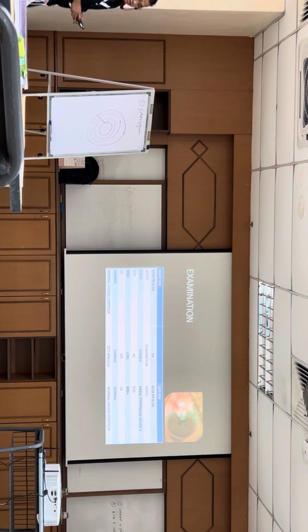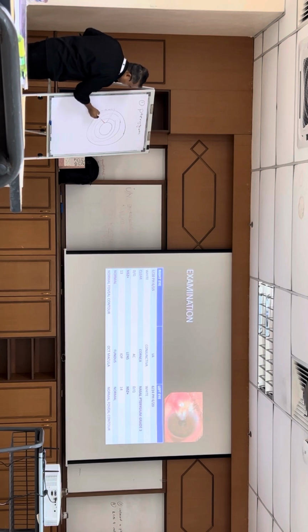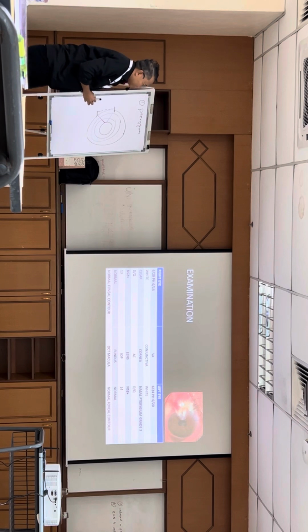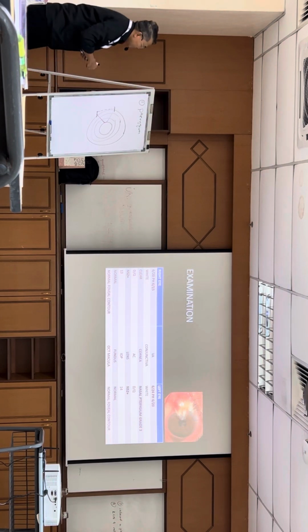The other thing I want to highlight is this. When you look at that, we actually look at the parameters in a different way from others to know how much this actually causes distortion to the cornea. You look at the clock hour, right? That clock hour is not that much. It's from 8 o'clock to 10 o'clock, about 2 clock hours, right?